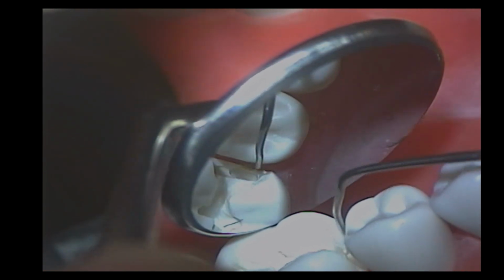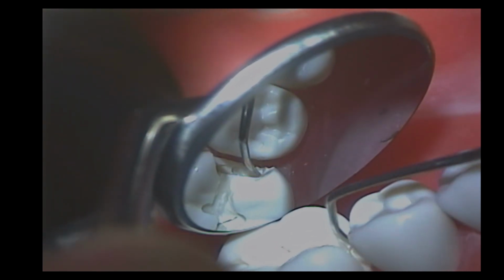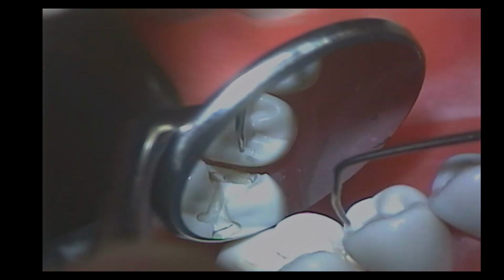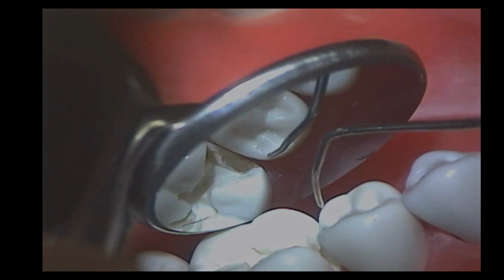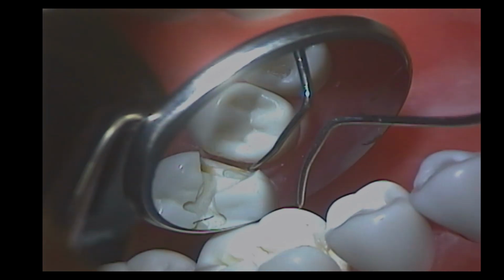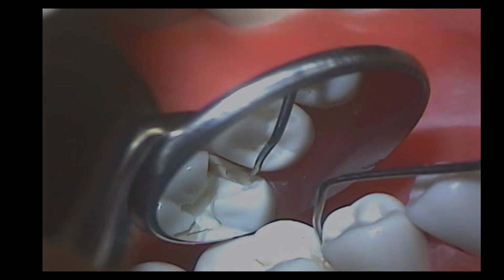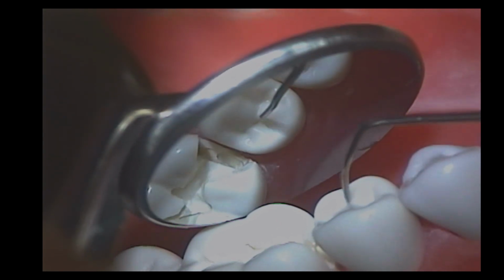Now, we did work a little bit to get you the next step of going gingivally there, so we haven't gotten rid of the excess in the gingival part of that wall. But the main thing about the proximal wall as you presented it to me is that you have three different areas, occlusal, middle, and gingival, and each one of those areas has a different exit angle.